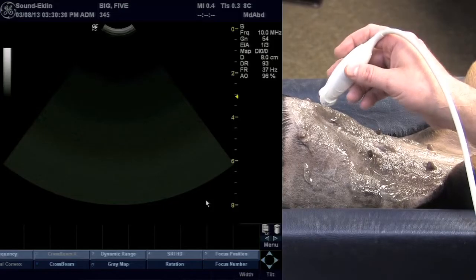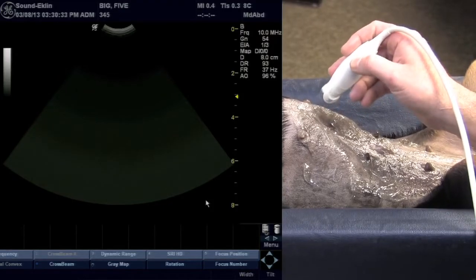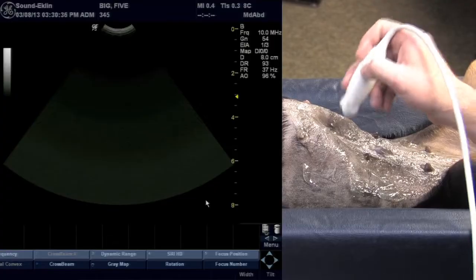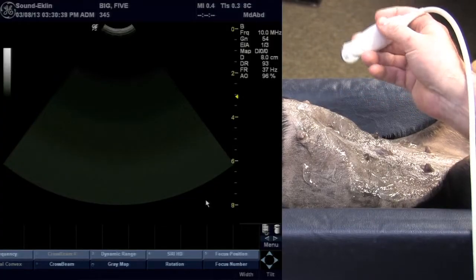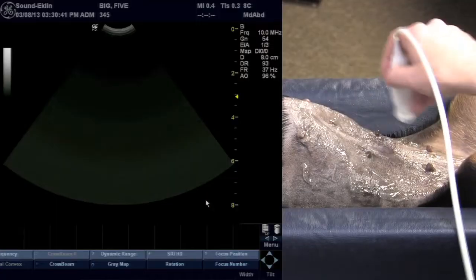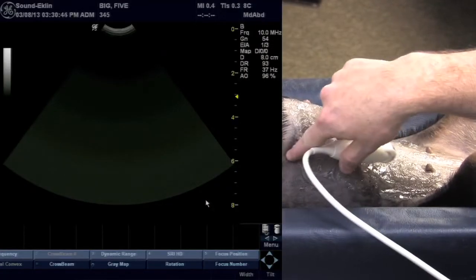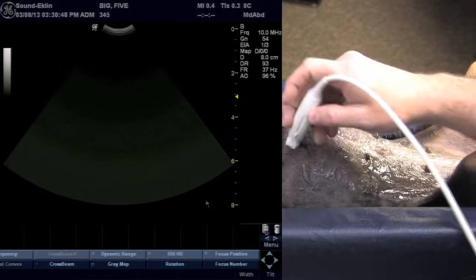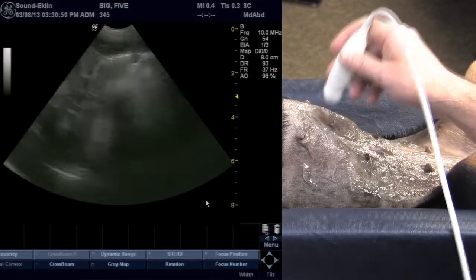We're going to begin our tour of the big five starting with the liver, then moving on to the spleen, kidneys, and urinary bladder. We've got the patient positioned in dorsal recumbency. The abdomen's been shaved — you can see where we've shaved at least three intercostal spaces to give us access to the liver if we needed to from an intercostal approach.